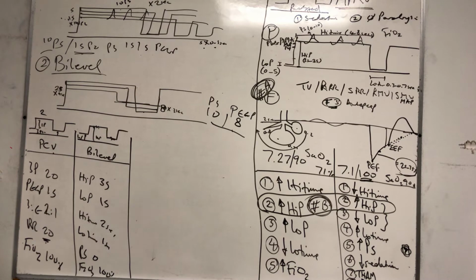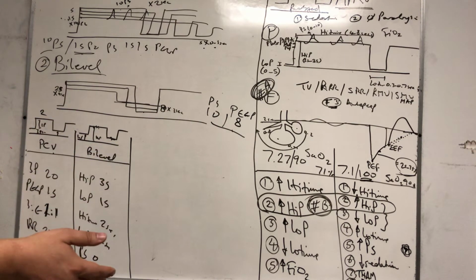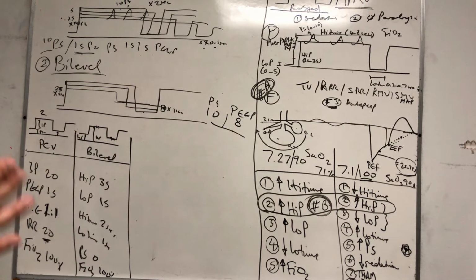We were a pressure control hospital, ICU. Patients would come to us, we put them on a 1-to-1 I to E ratio, and ventilate them that way. When we had 1 SBT a day, it was easy for the respiratory therapist, and it wasn't a stress on the system. The nurse turns off the sedation. By the time she calls the respiratory therapist, he finishes what he's finishing. By the time he comes, the patient is awake. You put him on a pressure support SBT, that's fine.